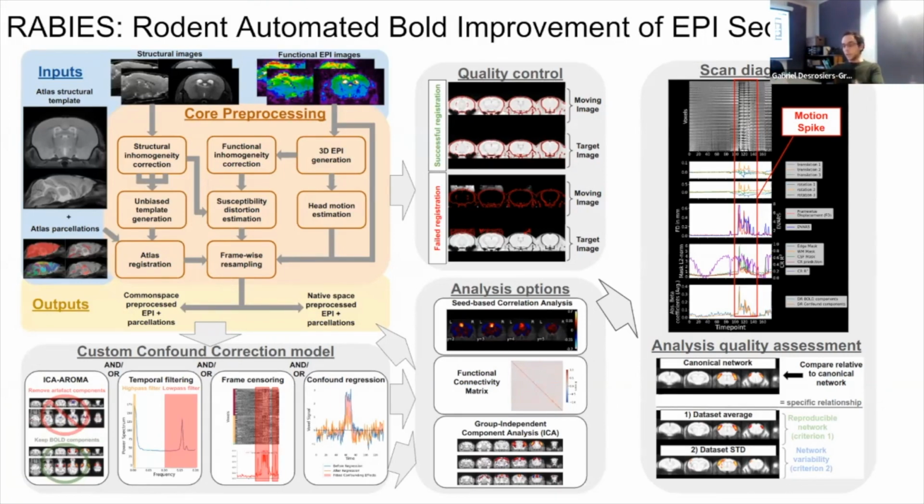And as I've already said, this is an evolving software infrastructure, especially at the level of data quality assessment. It's still evolving. The paper is not out yet, but hopefully will be in the pipeline soon. But in the meantime, you can consult the preprint.